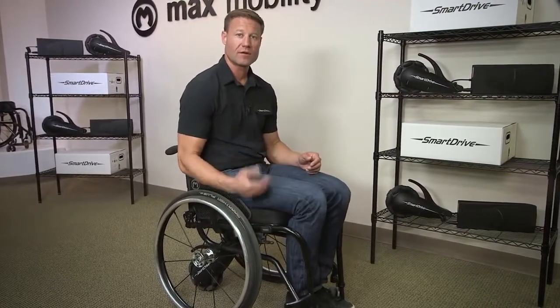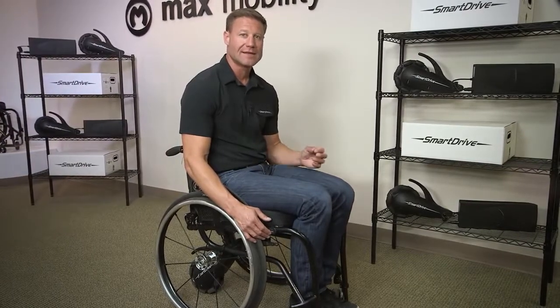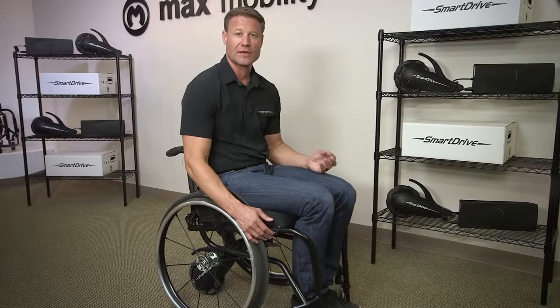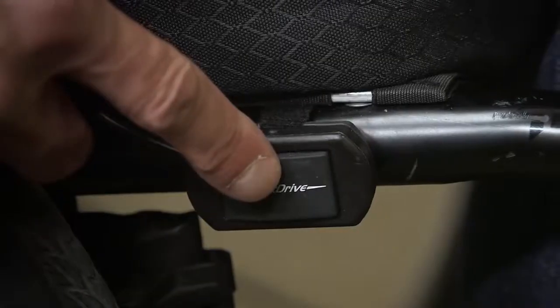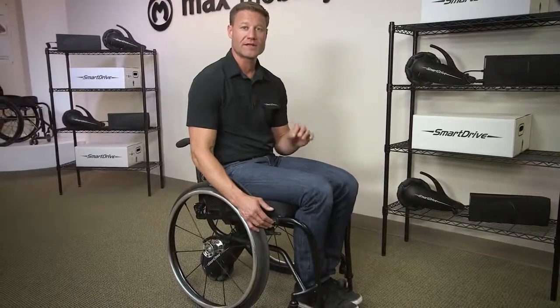To turn the SmartDrive on, press and hold either button for 1 second. The buttons are highly sensitive, so it does not take much force to hold it down. The light will come on and you'll hear a single short beep to know it's on. Once it's on, you can switch between modes by pressing a button.